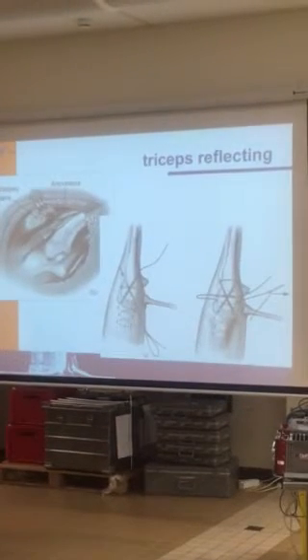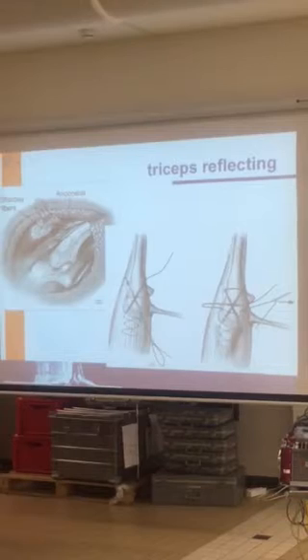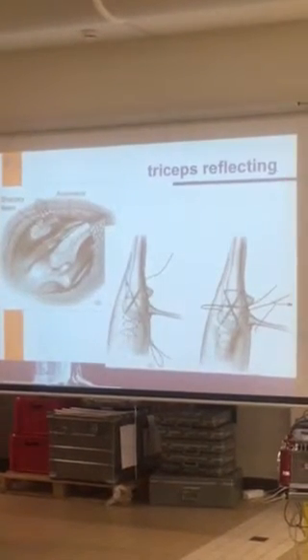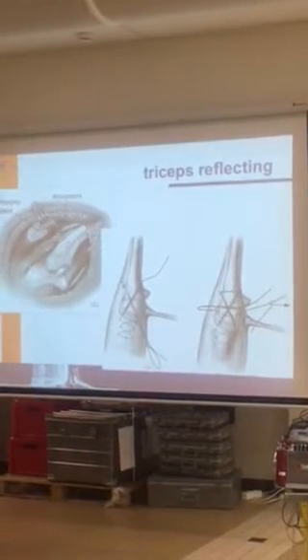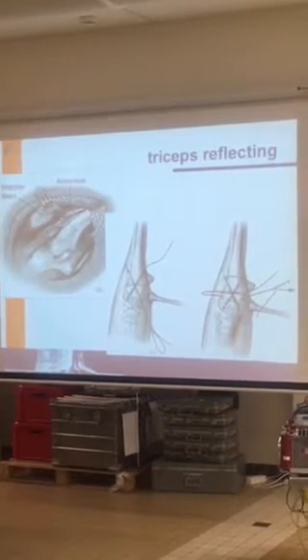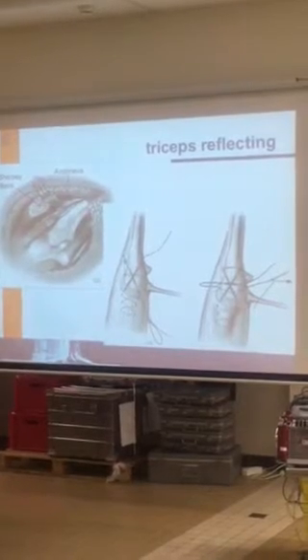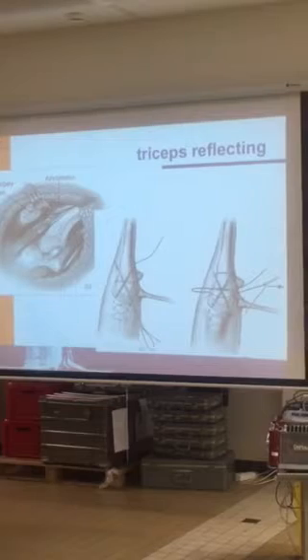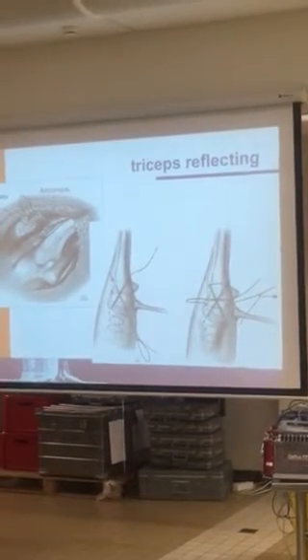So if you want to do reflecting, you take off the triceps, you come in general from medial and you turn off to lateral, and you go through the Sharpey fibers of the triceps insertion on the olecranon. When you finish with your prosthesis, you have to fix the triceps back, which means you must do transosseous suturing like it's demonstrated here. The problem with that is that I've done it twice.